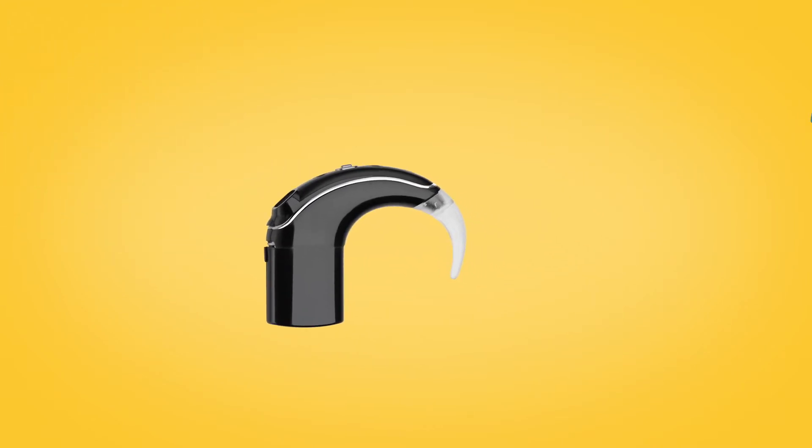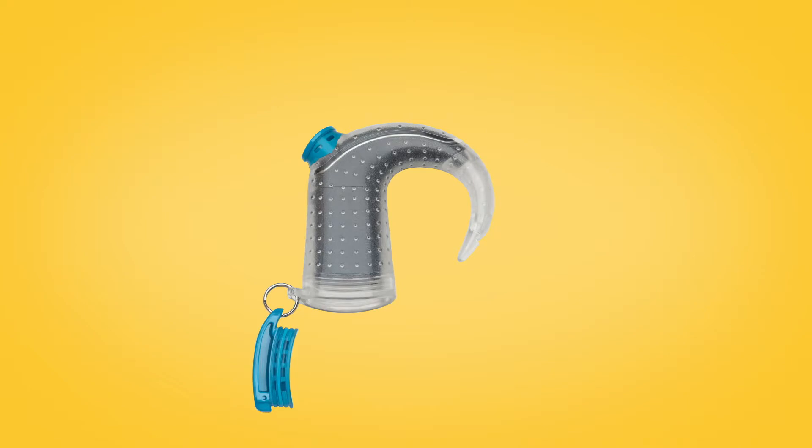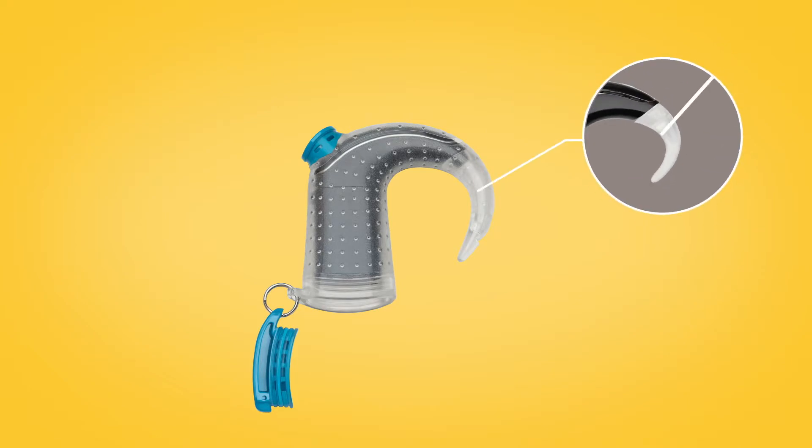Next, leaving your ear hook on, insert your Nucleus 7 sound processor into Aqua Plus. Be careful to avoid bending the ear hook or detaching it from the sound processor.